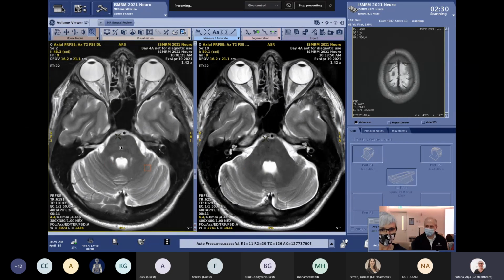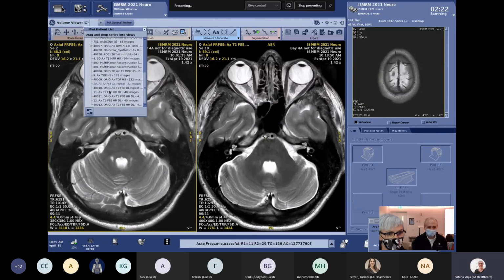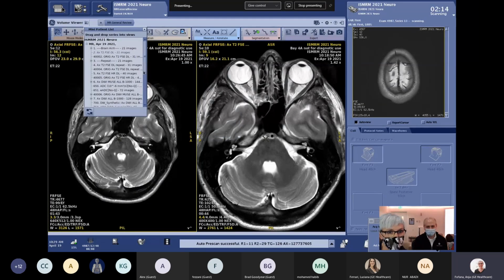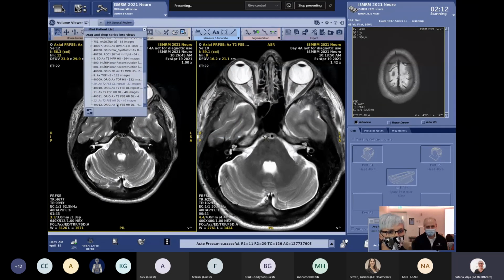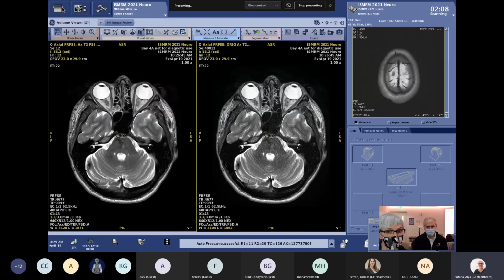So despite two different head positions, everything looks pretty much like it's in plane. Yeah, so it's a nice thing. So let's get the high resolution scan we did at the same time here. So we just go and show the high resolution scan, and then maybe we show the original images for that one as well, which is without AIR Recon DL.